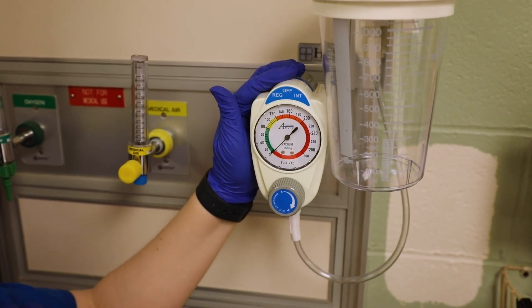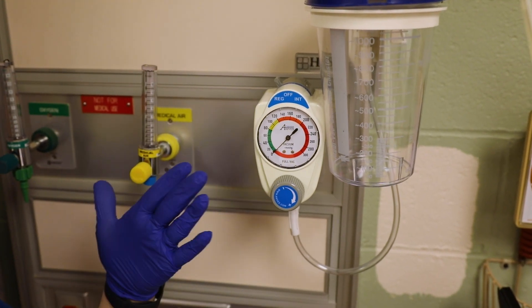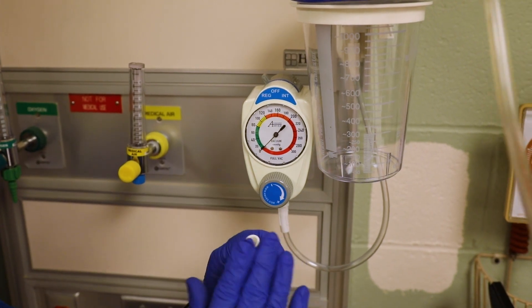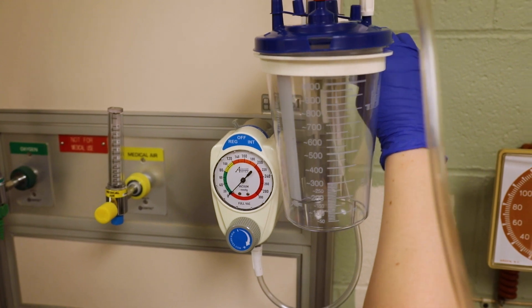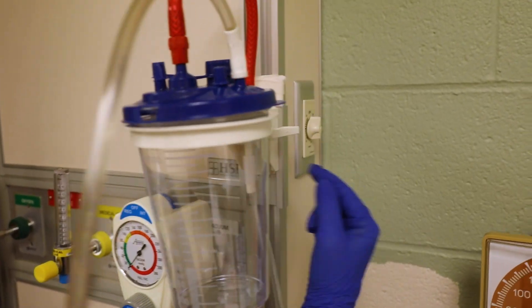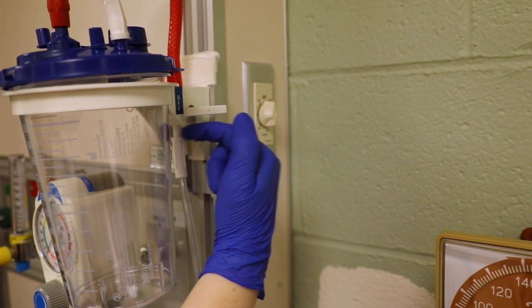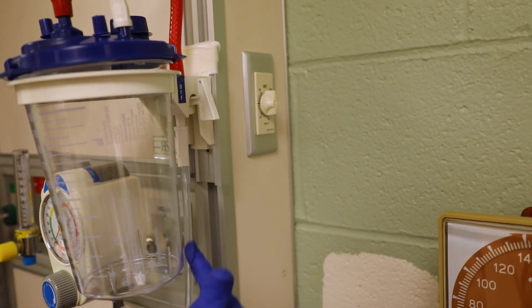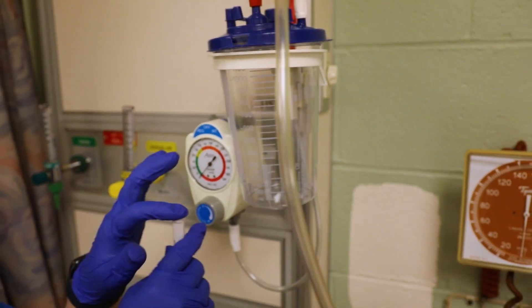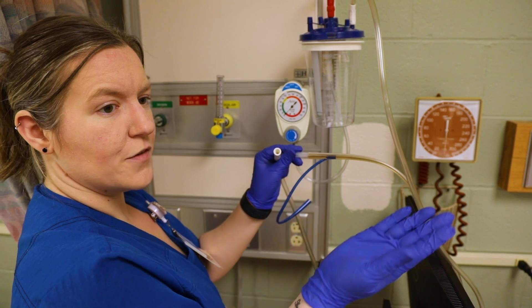If for some reason your machine is making the right suction noises but you're not getting suction at the end, there's this little tab over here. It could be horizontal or vertical. If it's horizontal, you're cutting off the flow — so you want to make sure it goes vertical. That'll open up your flow and then you should be able to get good suction.